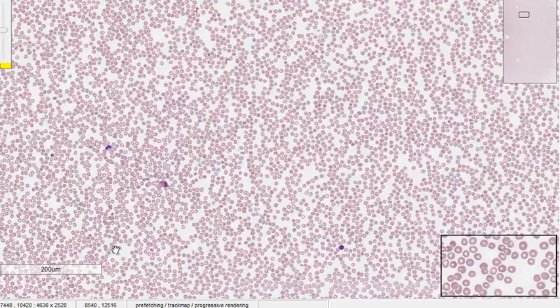So the first slide will be uploaded on YouTube, and the source of the slides will not be provided, and for the second slide I will provide the source of the virtual slide as well as the explanations. The initial slide is, as told, for the students to look into and to reach a diagnosis themselves. In the initial slide, after a period of time, a link will be provided to reach the second slide where the answer or the explanations are provided. So that is the plan, and let's go right into it.